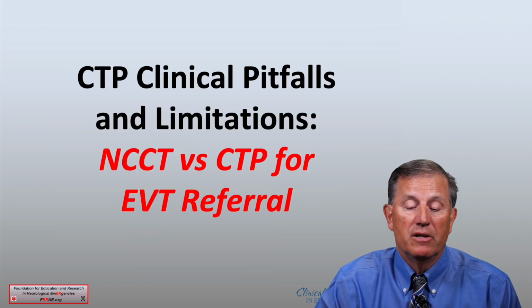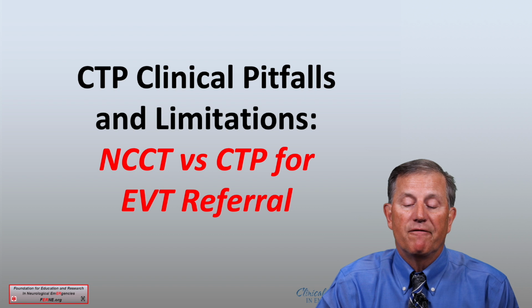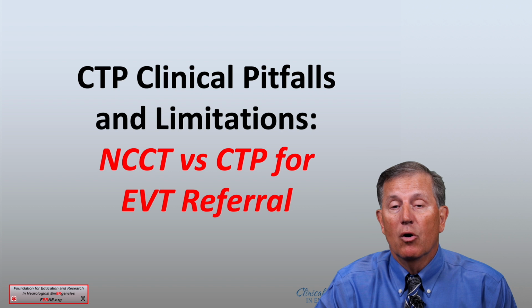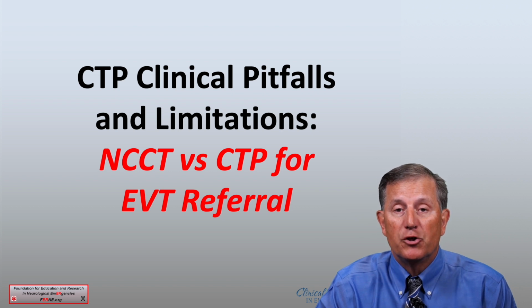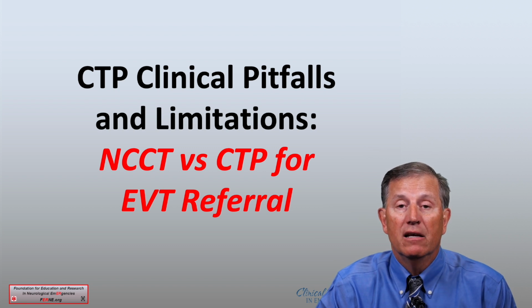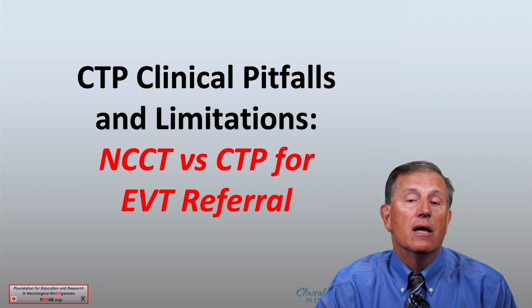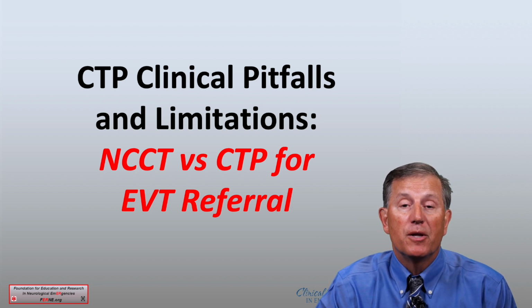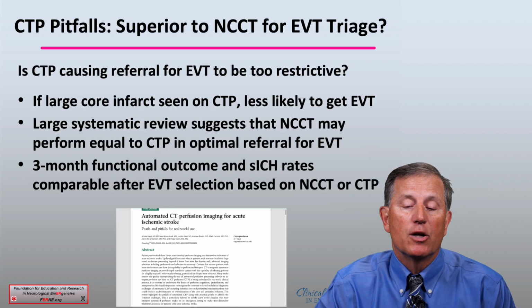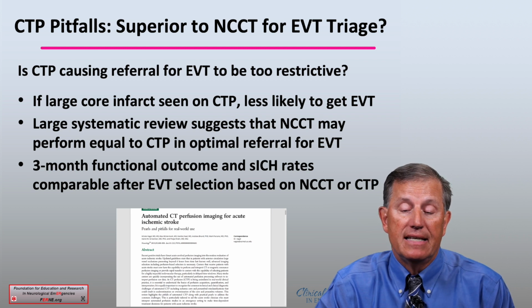One last consideration, non-contrast CT versus CTP for EVT referral. What are we talking about here? In patients who are evaluated in centers that do not have CT perfusion, can you refer patients for EVT accurately and send them to a comprehensive stroke center just from the use of non-contrast CT? So, is CTP causing referral for EVT to become too restrictive? And should we use just an NCCT in order to evaluate for the need for EVT?